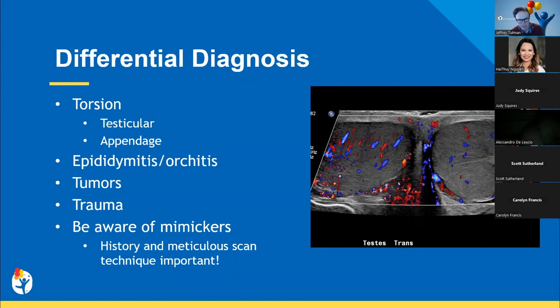Just thinking about our scan technique, we'll give you a couple of different tips on things we can do to try to differentiate some of these challenging cases. And then the other thing that we'll really focus on is the history of these cases. The history of these patients can really give us a lot of information.